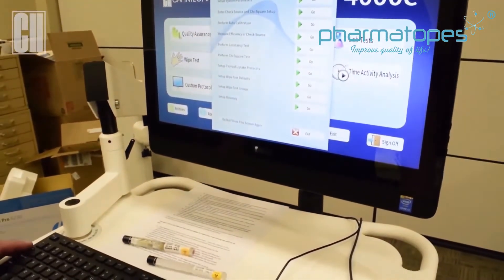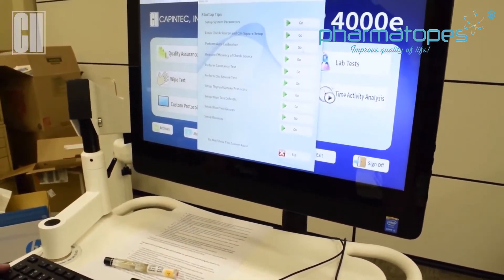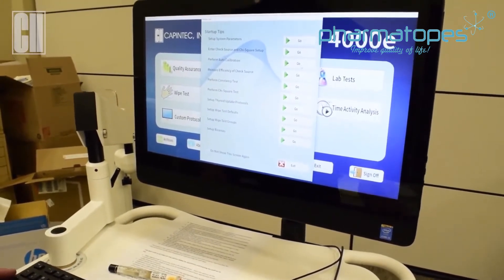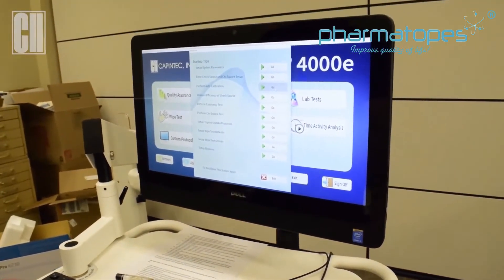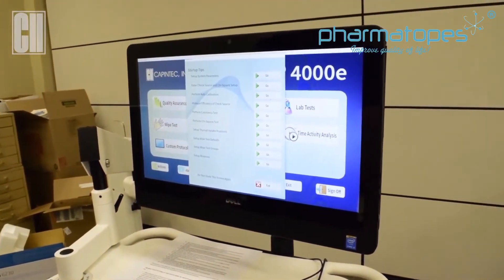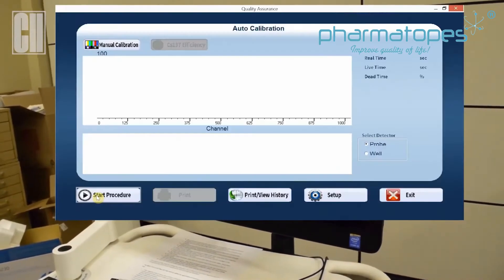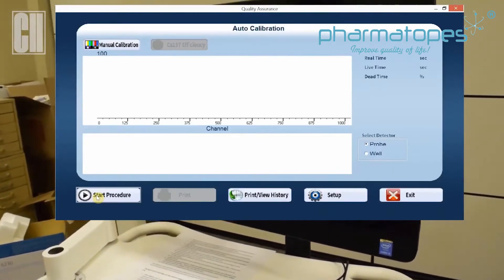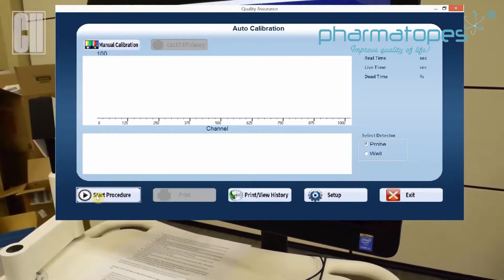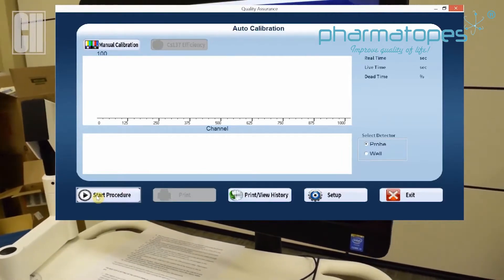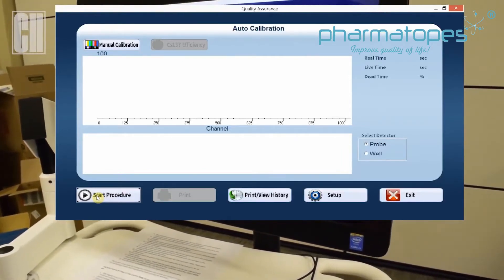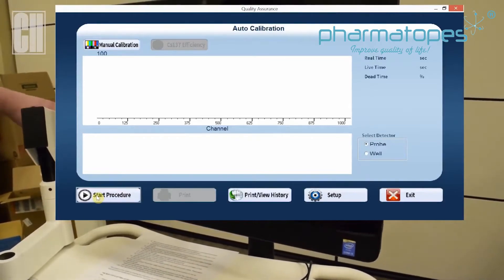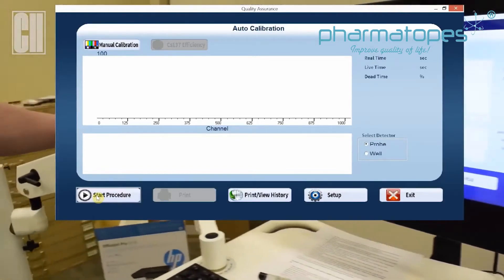Now we can perform the calibration to make sure we're getting successful calibrations on both detectors. We'll click on that, and here will be your main screen for doing your calibration. You have your option over here for which detector you'd like to calibrate. Once you decide what detector you're calibrating, we're going to do Start Procedure.